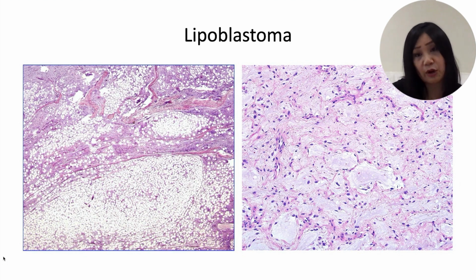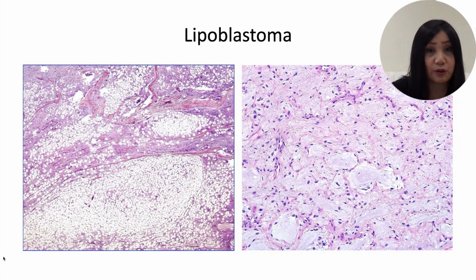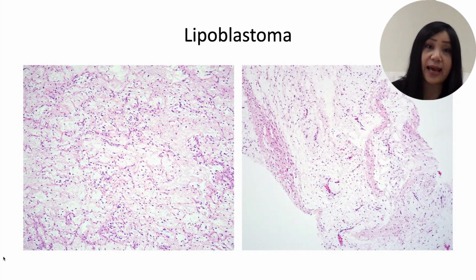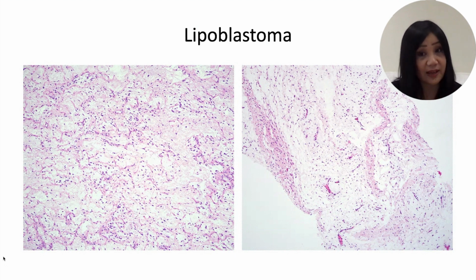And on the right, the stromal component shows myxoid cysts, and these very bland ovoid cells without discernible atypia, mitotic activity, or necrosis. And these vessels, thin-walled vessels, largely medium-sized in a curvilinear distribution. Some more examples in which the adipocytic areas are rare or lacking. And again, we can see this very prominent stromal component with the curvilinear vessels, bland ovoid and spindle cells, variably resembling myxoid liposarcoma.